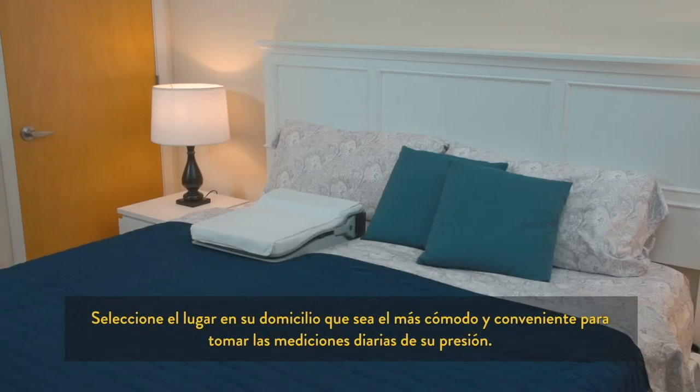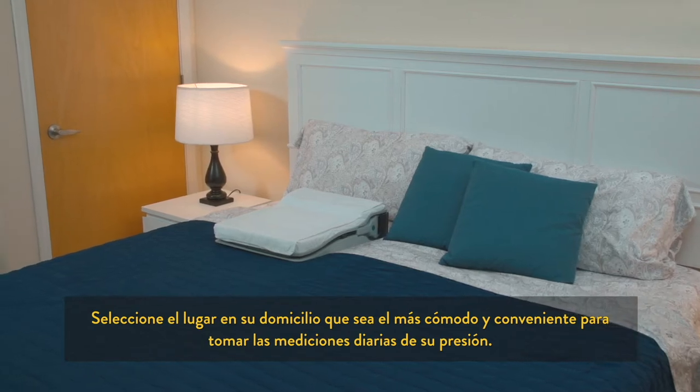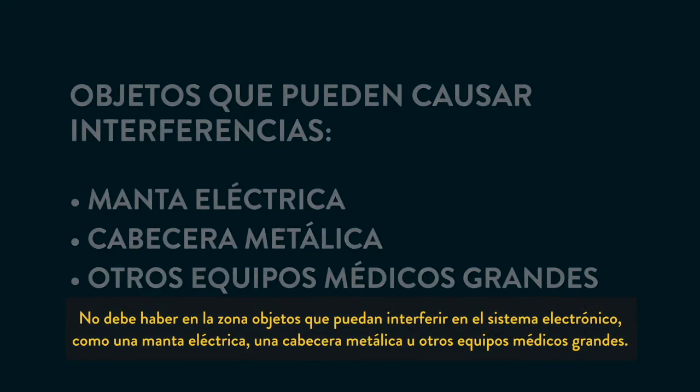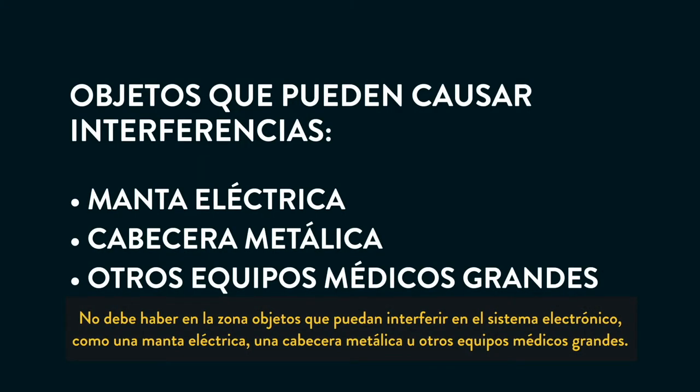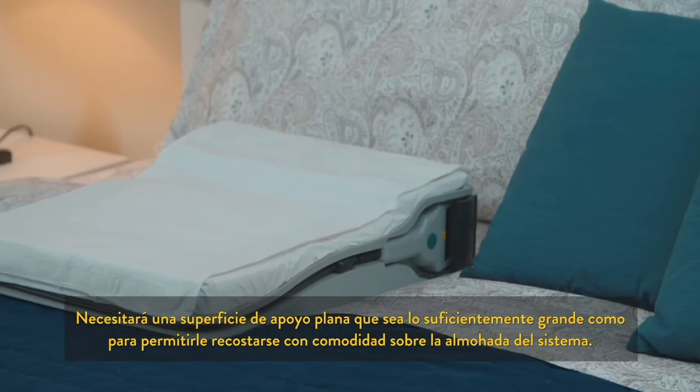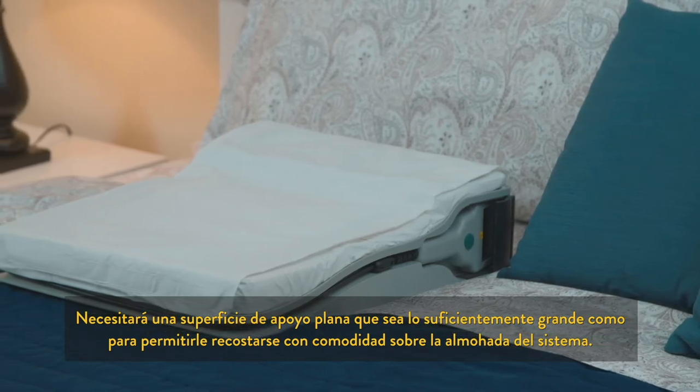Select the location in your home that will be most convenient and comfortable for taking your daily readings. This area should be free of objects that could cause interference with your electronics system, such as an electric heating blanket, metal headboard, and other large medical equipment. You will need a flat, supportive surface large enough to comfortably lie down on the system pillow.